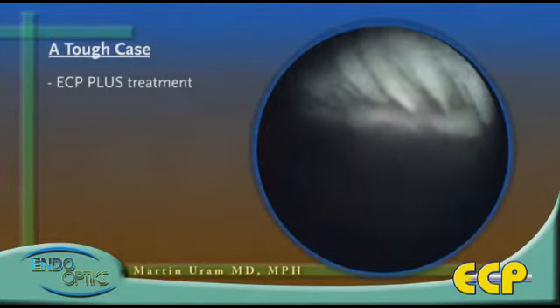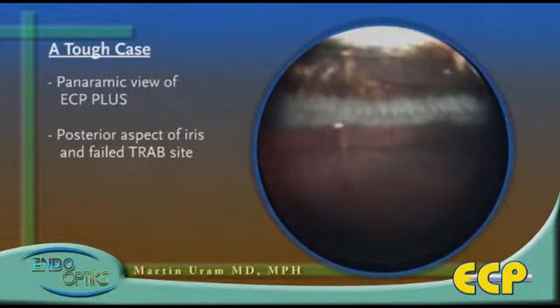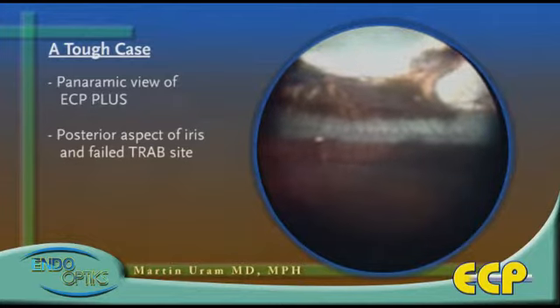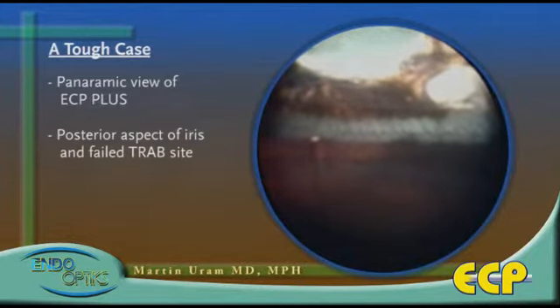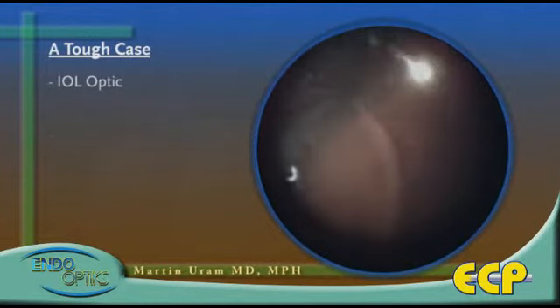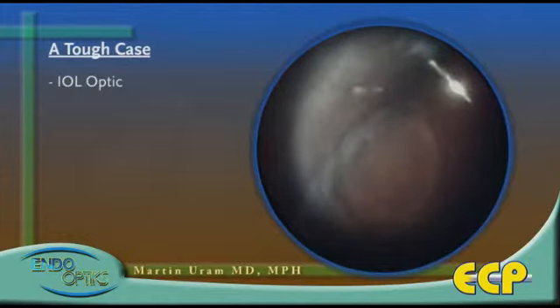The more of the pars plana epithelium that's lasered, the lower the intraocular pressure will go. However, one does not want the lesion to extend anterior to the sulcus because that tissue does not produce aqueous, and such treatment will only result in inflammation.